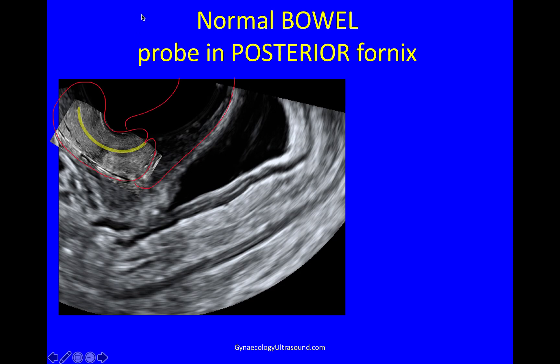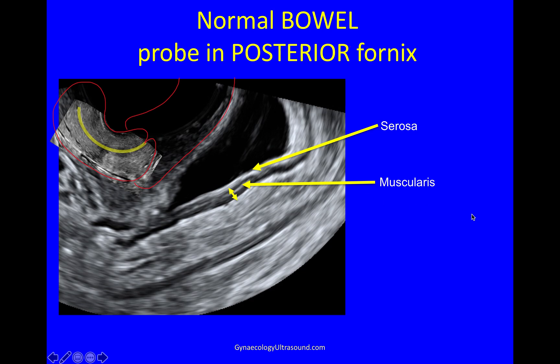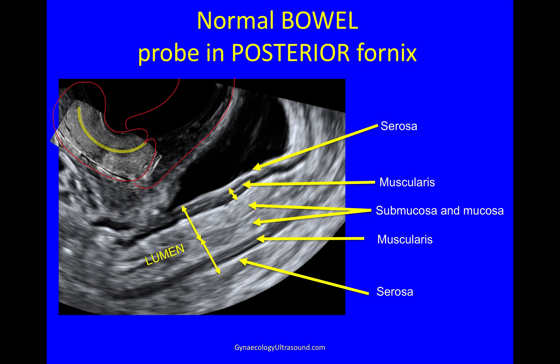And what you can see, outlined nicely by some fluid, is the different layers of the bowel. The white is the serosa. This hypoechoic area comprising two layers is the muscularis — the outer longitudinal layer and the inner circular layer — with a little bit of fibrotic tissue between them. This is a normal muscularis, covered by submucosa and mucosa. The same on the other side, and then this is the posterior wall muscularis and serosa. So the lumen of the bowel is just there.